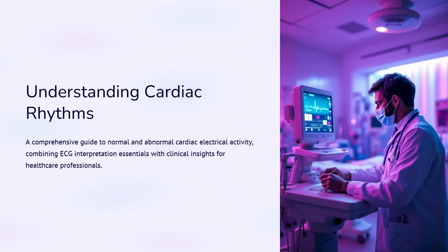In today's lesson, we'll explore cardiac rhythms, how the heart's electrical system works, how to identify normal and abnormal rhythms, and what they mean for patient care. By the end of this presentation, you'll understand the key differences between normal sinus rhythm and the most common dysrhythmias seen in clinical practice. Let's get started.